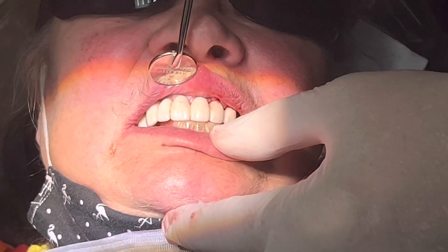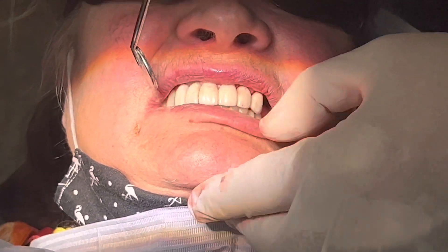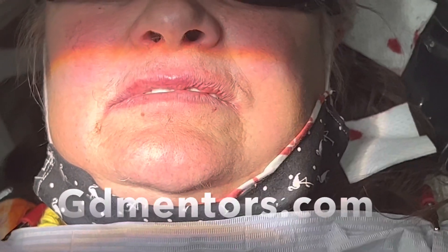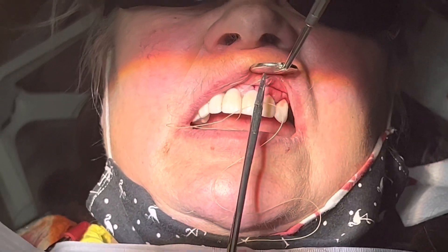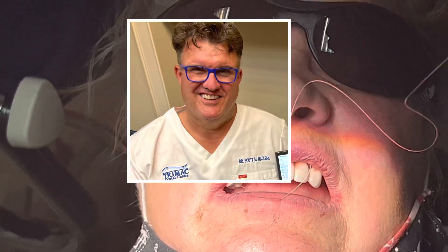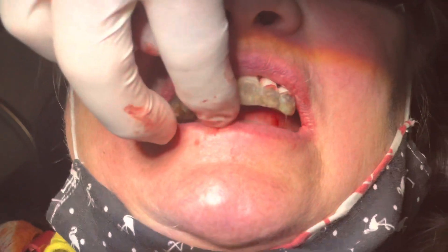We'll light cure with a deep curing light and check the occlusion, making sure it's all good, because she'll possibly be biting on the resin I just placed. We need to get her to get some posterior teeth — implants, a partial, or something that will help support her bite, because lateral forces on this are going to be a problem. Put the suture in and send her on her way. Please share this with others — this is Dr. Scott McLean, and this has been a presentation about implant dentistry. Have an amazing day.